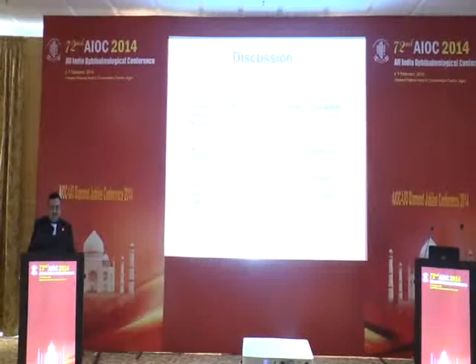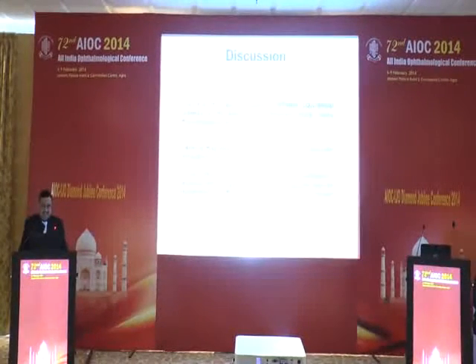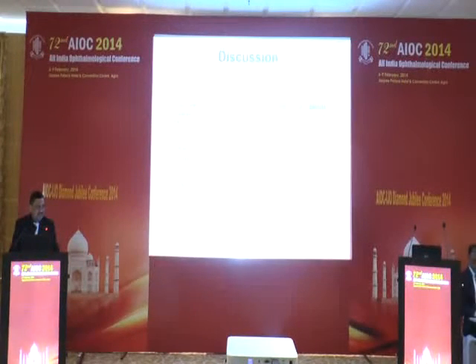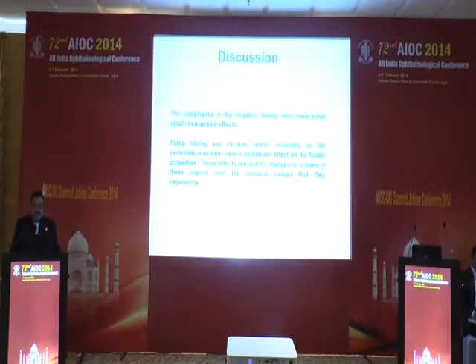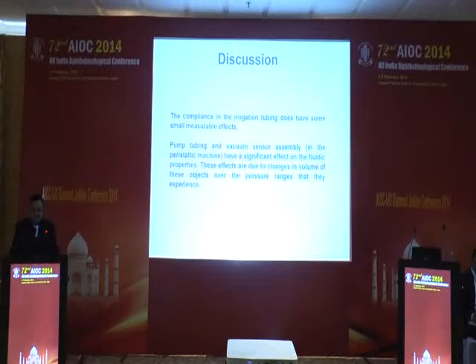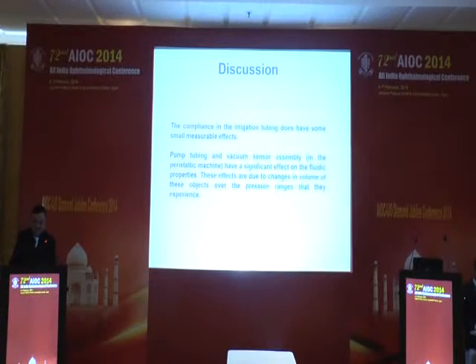So when there are variations in atmospheric pressure, whatever gradient you achieve in the dynamics cannot exceed the normal atmospheric pressure. These variations of around 15 to 20% definitely require higher settings to achieve optimal efficacy of the system. The second option is the compliance of the irrigation tubings. If we can have altered tubings and sensors, probably the difficulties of managing at high altitude can be minimized.